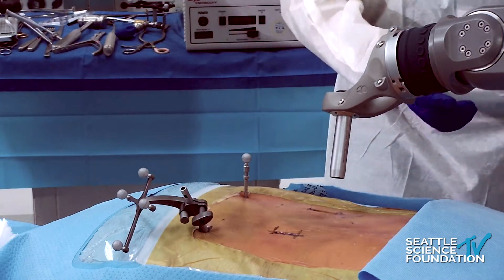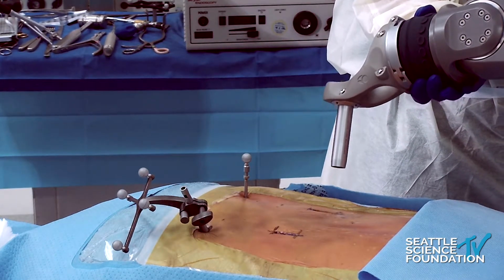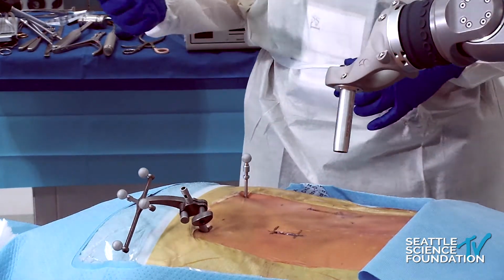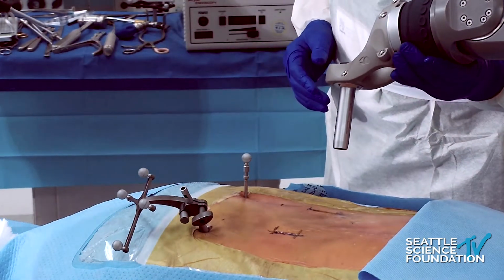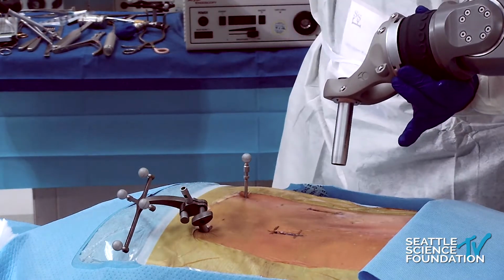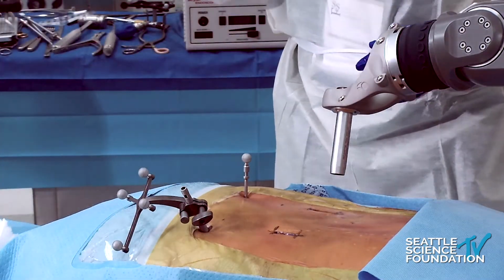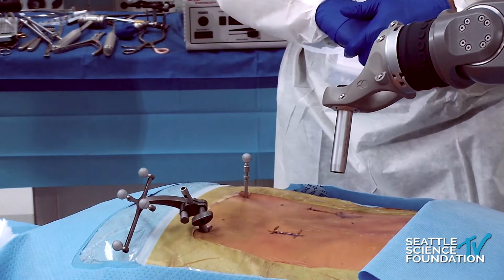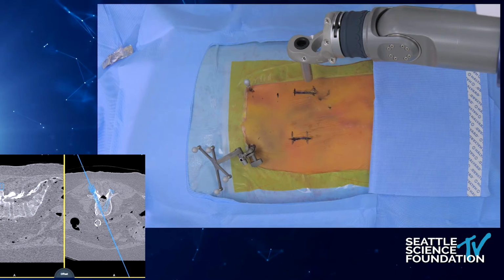Now, if I wanted to remain on target, and let's say it was a particularly big patient, and the end of the end effector was either in the skin, as what you'd find with, for example, an SI joint fusion, which I found this to be ideal, I'm able to bring this up and down in line, as you can see, in line with that trajectory. And the yellow just tells me that I'm not on target with respect to the screw. So if I press that, it'll make that correction for me. Or it should make that correction for me.